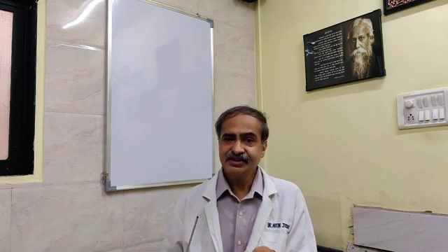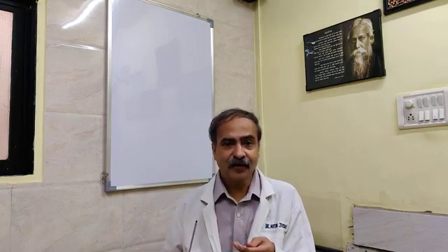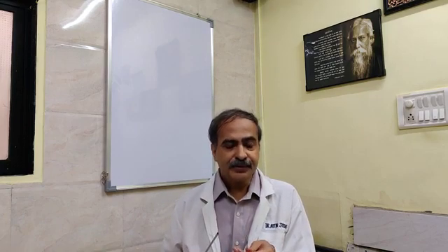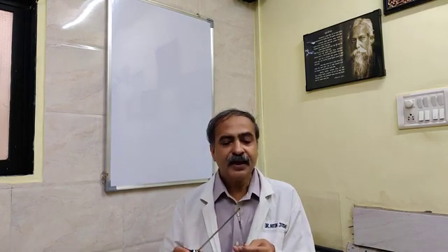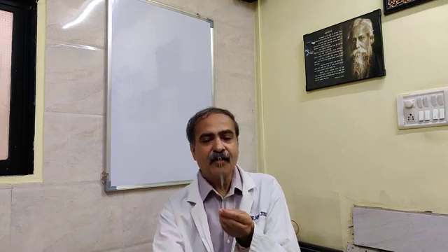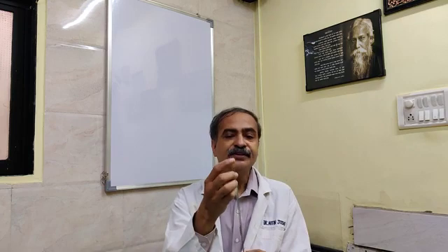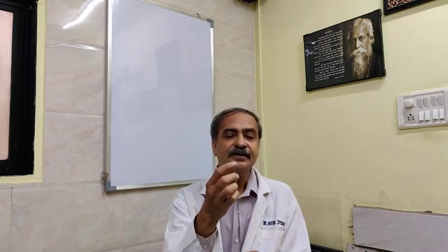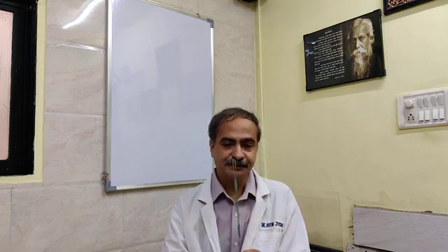Now this bladder neck incision is carried out by what is called the Collins knife or hook. It is also a type of active electrode. It is called a hook or knife because the part with which the tissue is cut has the shape of a knife or the shape of a hook, hence the name Collins knife.